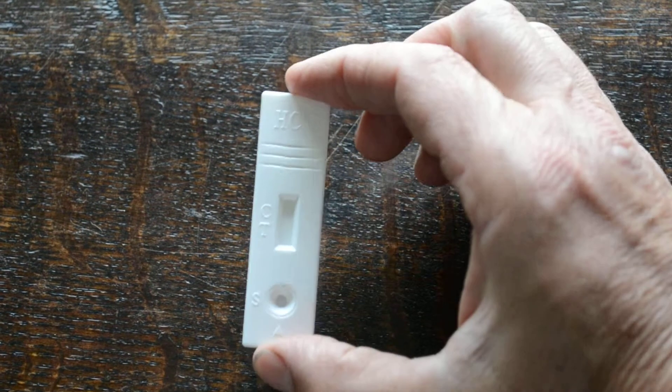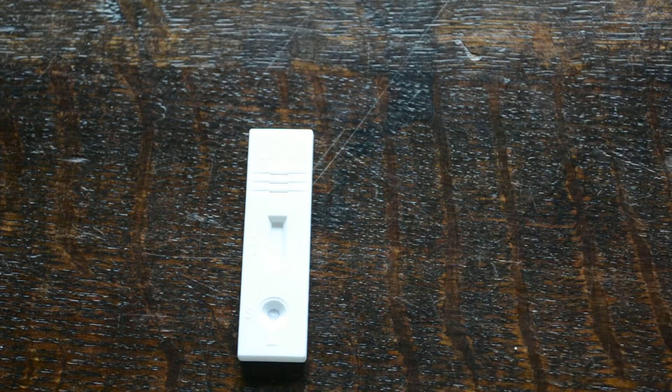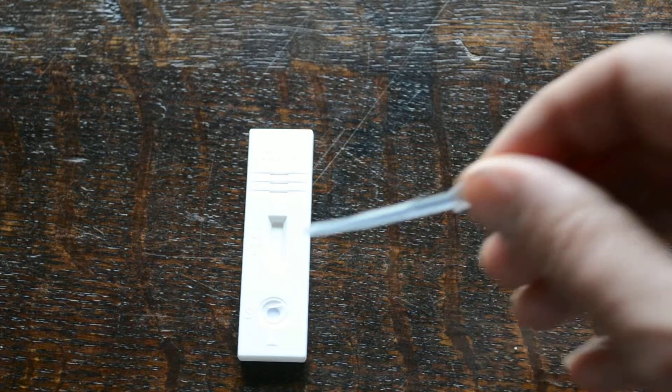Here we've got the test cassette — standard format, HCG written on the top, C and T marked on there, and S for the sample well. What we're going to do is run it for you by adding one, two, three drops with the pipette.